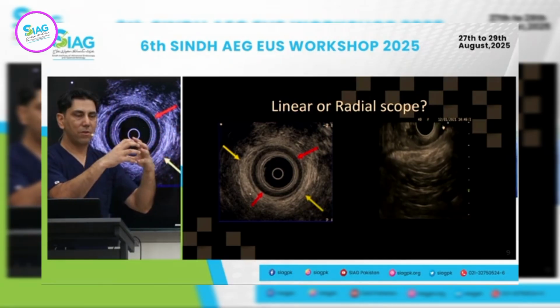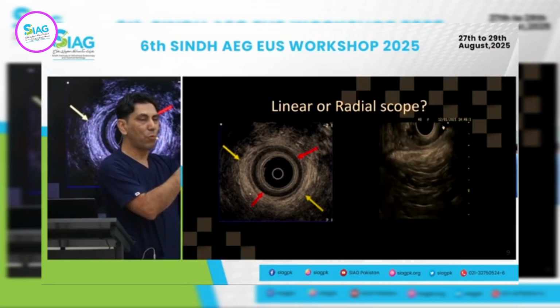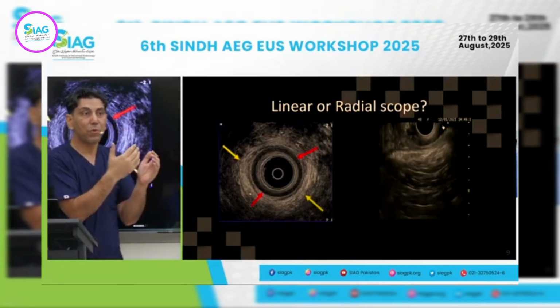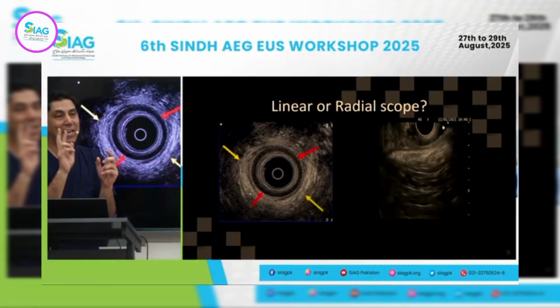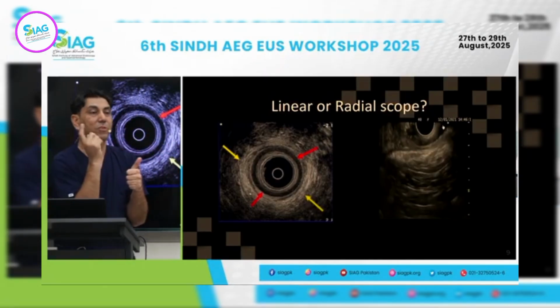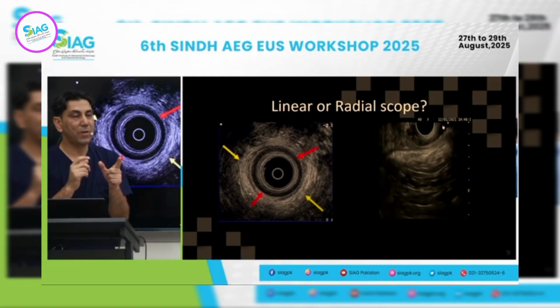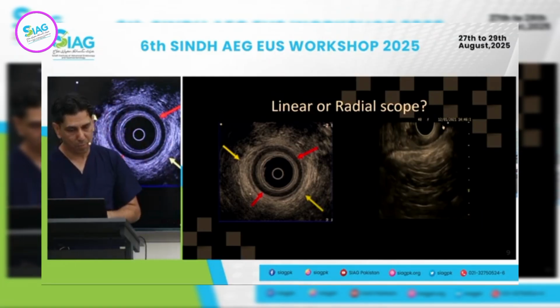So there's a coupling of interface of the probe or the balloon with the mucosa, and then we've got the mucosa, submucosa, and in that we've got a muscularis mucosae. So the 2 black layers are your muscularis mucosae behind the bright layer of the submucosa. Then we've got the muscularis propria, which is also going to appear black. So 2 black layers: muscularis mucosae and muscularis propria.